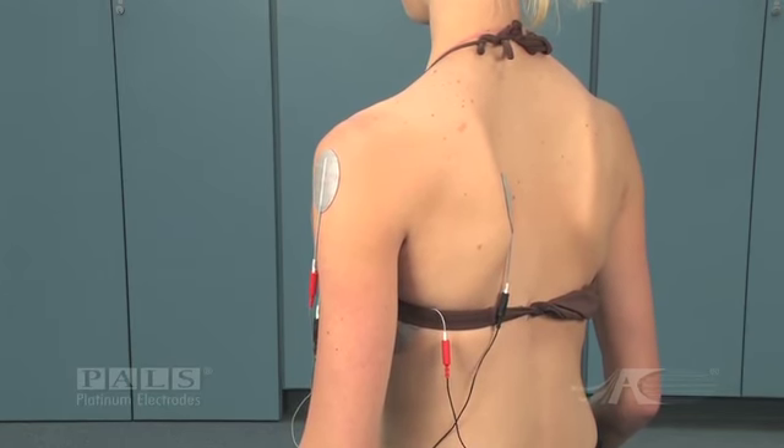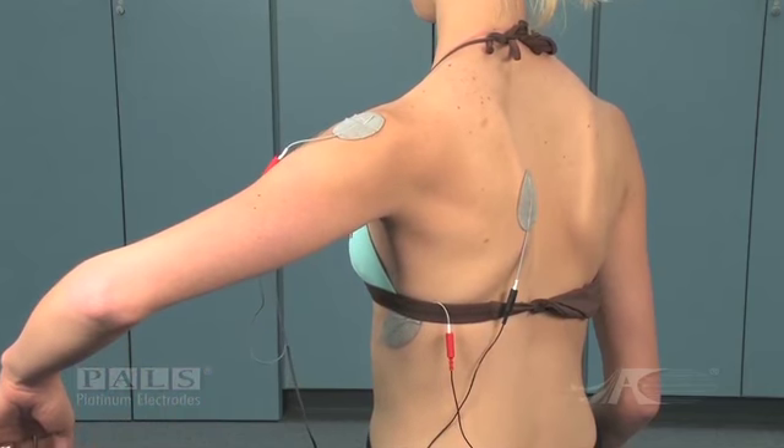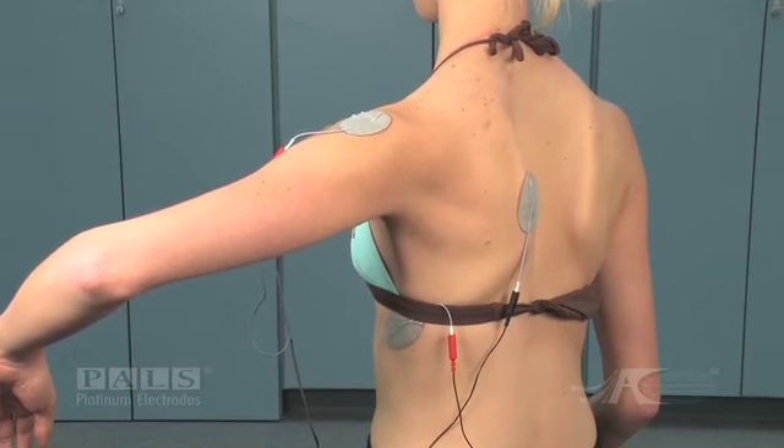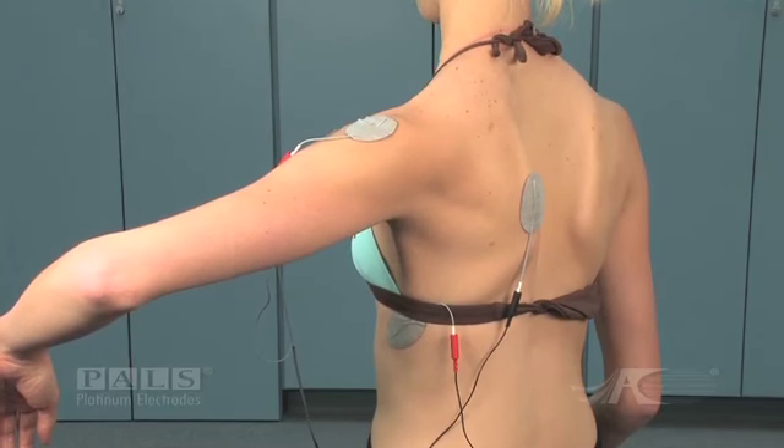The first channel is placed over the anterior deltoid and the middle deltoid for shoulder flexion. The second channel is placed with the negative electrode under the scapula, and the positive electrode down on the belly of the serratus anterior.